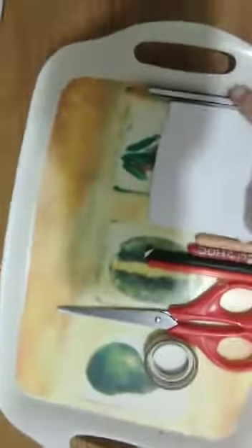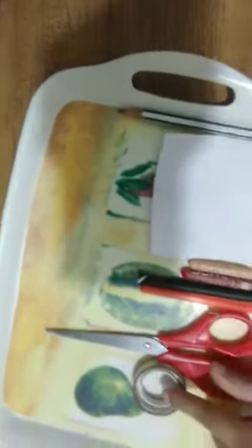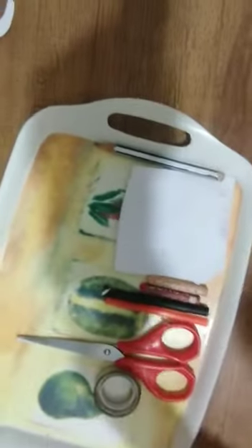We need pencil, paper, colors, straws, scissors and cellotape. Make a drawing of a rocket on a sheet of paper, then color it and cut it. Take a straw, cut it short, then cover one end with tape.